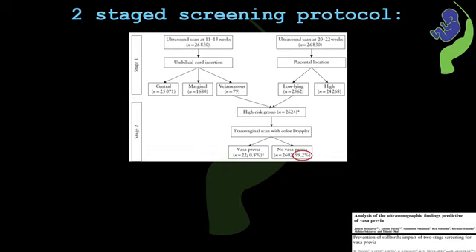I would also like to add one more practical point from my clinical perspective. Even marginal cord insertion identified in the first trimester should remain under our surveillance. Although not traditionally included in the high risk category in this cohort, marginal insertion can progress to furcate or even velamentous cord insertion as pregnancy advances. Therefore, keeping them under observation helps us to exclude even the slightest possibility of having vasa previa.